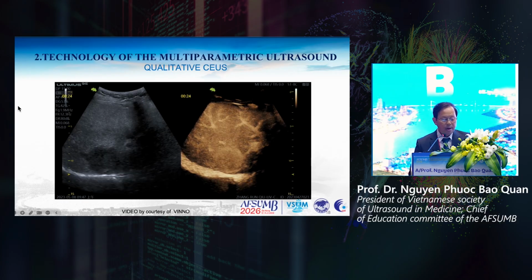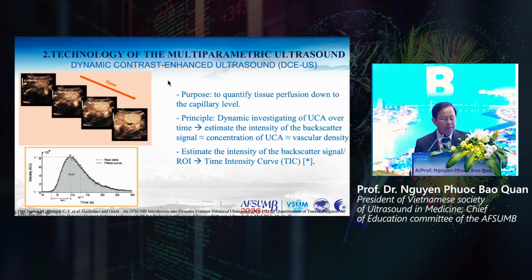And we can use dynamic contrast-enhanced ultrasound to obtain a quantitative measurement of the enhancement of the liver lesion.